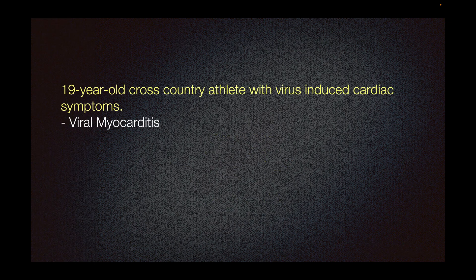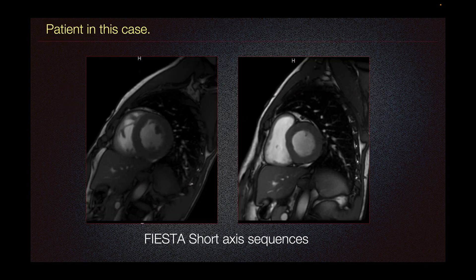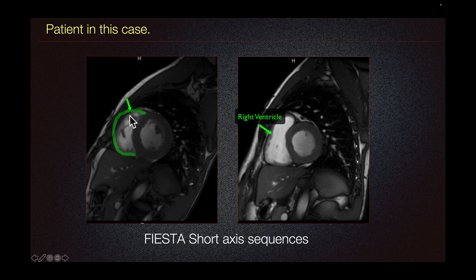This is a case of a 19-year-old cross-country athlete with virus-induced cardiac symptoms concerning for viral myocarditis. The patient received cine images of the mid-heart short axis. Here on these two images we see mild dilation of the right ventricle but normal appearing left ventricle with normal thickness of the left ventricular myocardium.